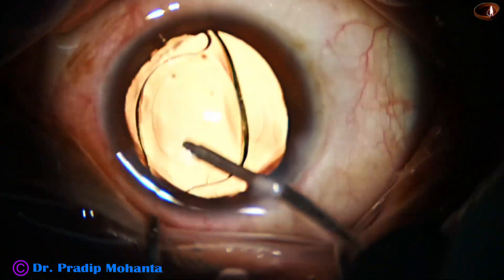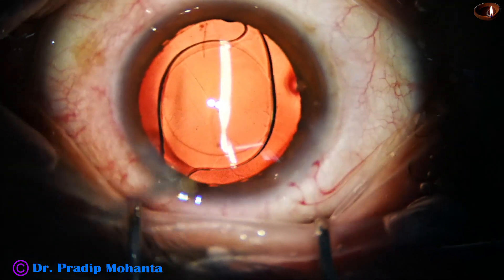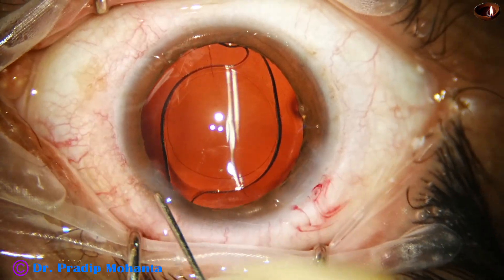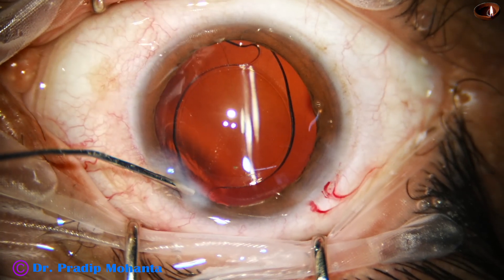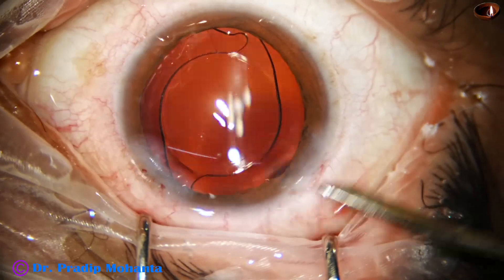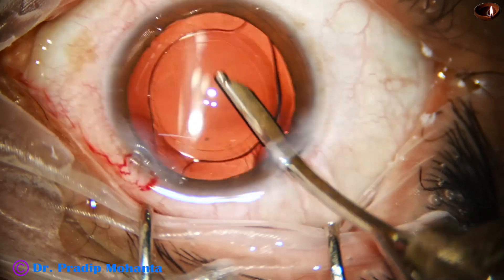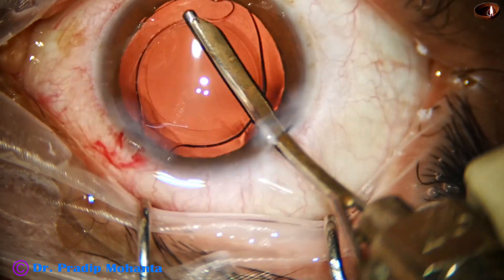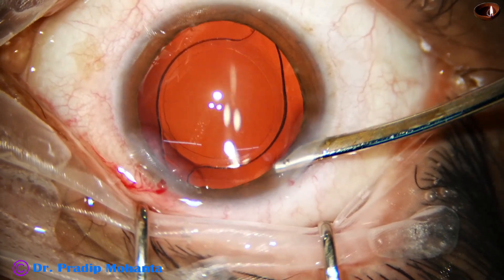We will see that the intraocular lens will be overlapped all around by the rhexis margin. So if we can train ourselves to do rhexis of this size, then a femtosecond laser is not required to do rhexis. See the rhexis — it is overlapping the lens all around. Even for a premium IOL, we can do this kind of manual rhexis.